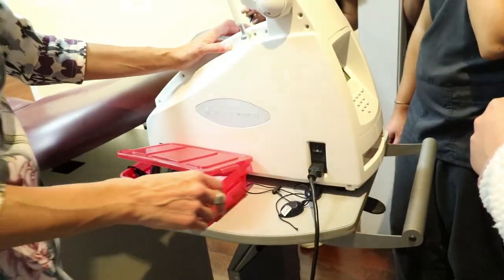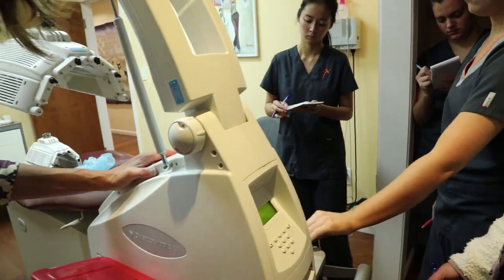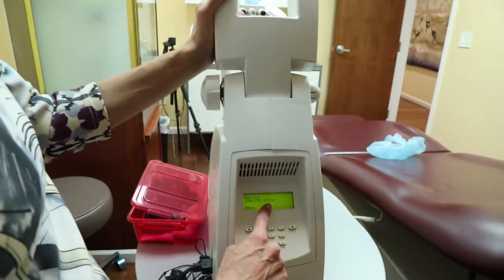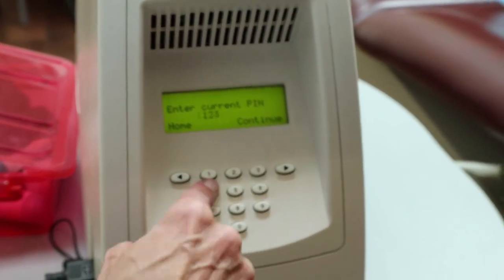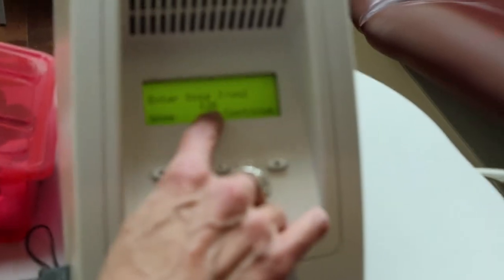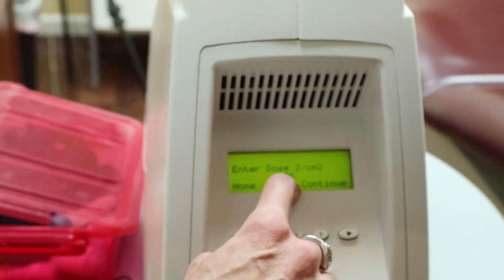The programming of the red light is going to be the same as the blue, but you will often go with joules here unless a specific number of minutes is specified. The display will have changed to 633 nanometers again. You'll obviously have to put in the pin one more time, then select time or dose. For acne, we want to deliver the max dose, which might be about a 22 to 25 minute treatment. Hit continue.